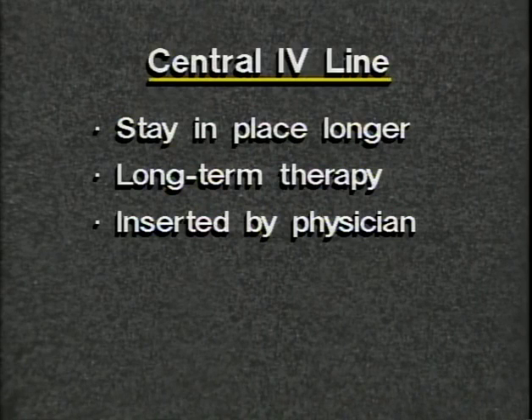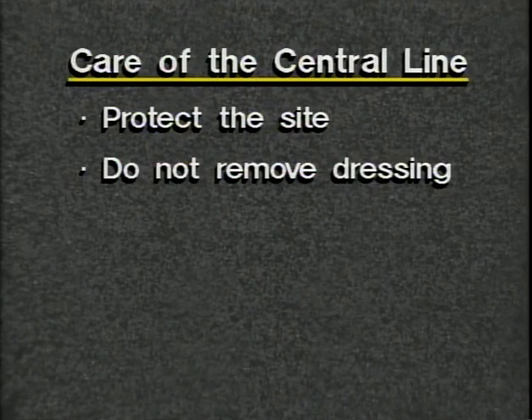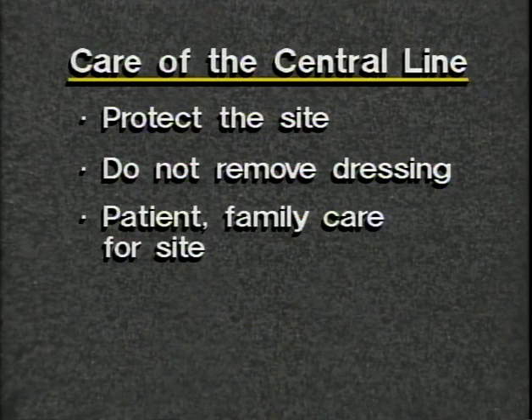The central line requires insertion by a physician, usually in the hospital setting, using a local anesthetic for insertion. Protect the central line site during care delivery. The patient must always keep a dressing over the central line site. Do not remove this dressing. The nurse will teach the patient or family member how to clean the site using an antiseptic and change the dressing, following the procedure as ordered by the physician. The physician will give instructions regarding bathing and personal care.